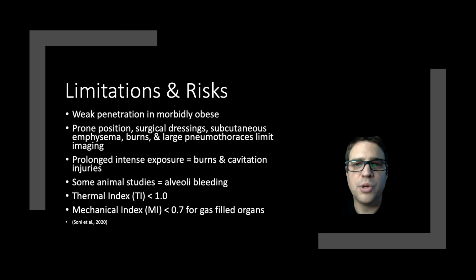In addition, prolonged exposure to intense ultrasound beams can theoretically raise the temperature of the body site being examined by as much as 4 degrees Celsius, causing local thermal injuries. While the negative pressure created by sound waves as they pass through the body's tissues may pull gas out of the tissue solutions, causing cavitation or gas bubble formation injuries, and these are called mechanical injuries. Finally, in some animal studies, the air-filled lungs were susceptible to perialveolar hemorrhage with direct exposure to ultrasound scans using B and color flow mode.